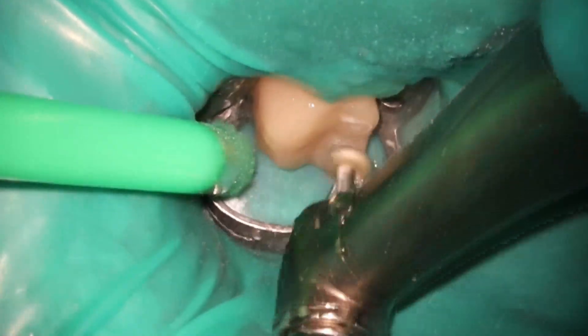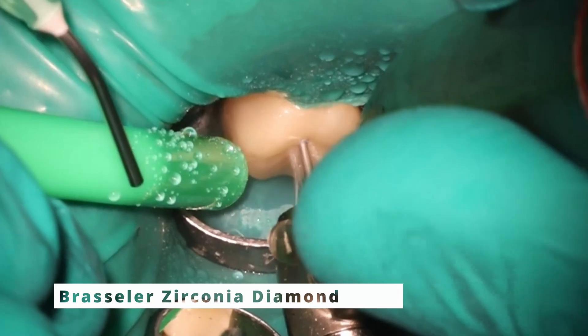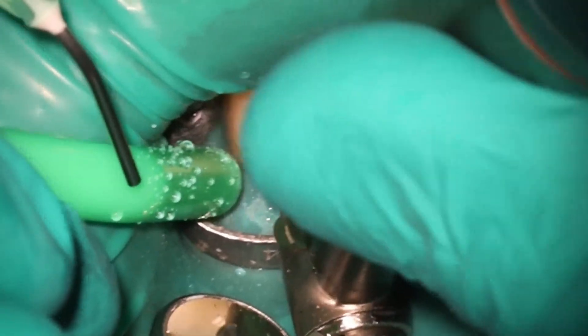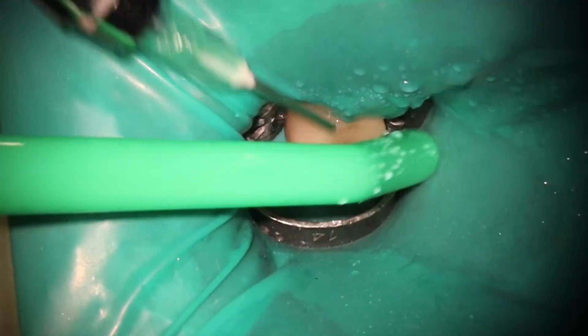First thing is always take out the bite, just kind of lower it down a little bit, and we're going to go ahead and access through. As you can see from the pre-op, this was an E-max lithium disilicate, so we've got to access through that. That's where those purple diamonds are really useful as well.